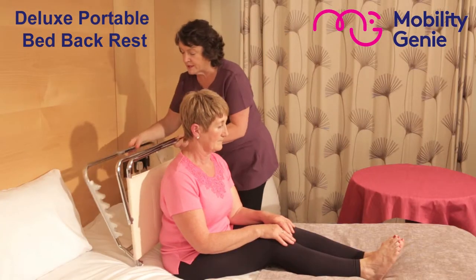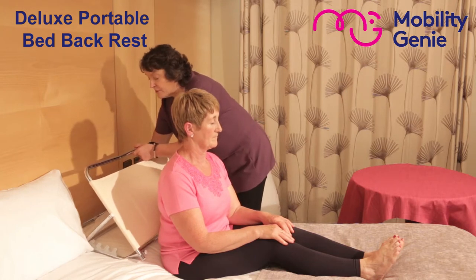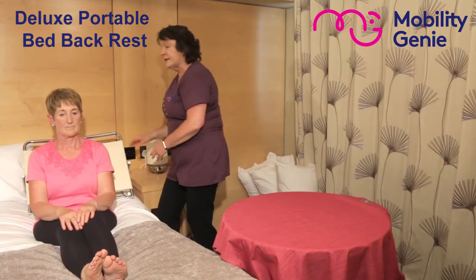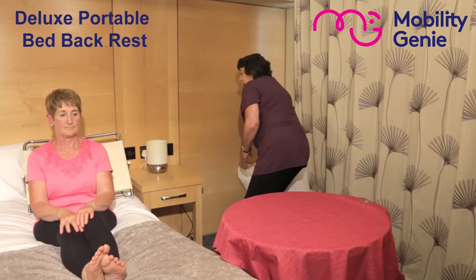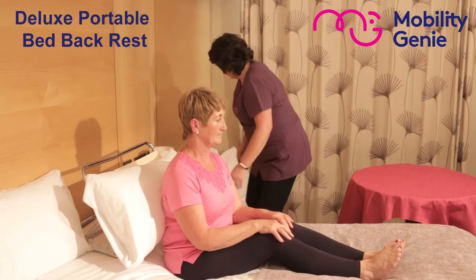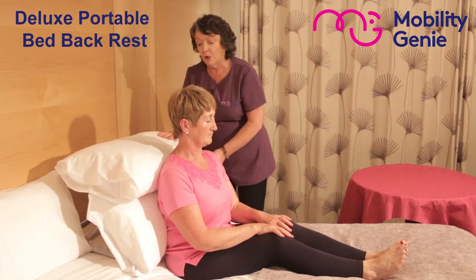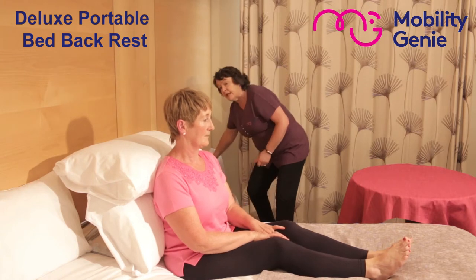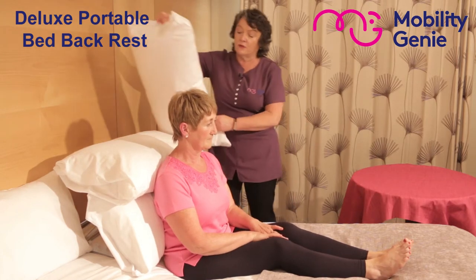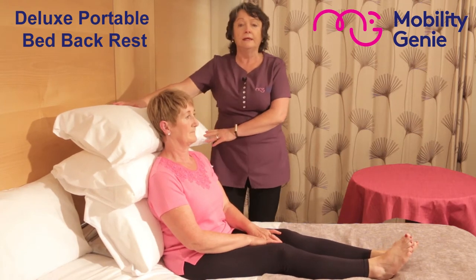For the purpose of this demonstration, I'm going to set it at the second last rung, which will give a nice comfortable sitting position to Margaret. And we're going to add the pillows. This would be similar to a hospital experience where you'd have the bed with the bed backrest attached to the bed. This gives you the option of having a portable with an ordinary bed and it's transferable easily.